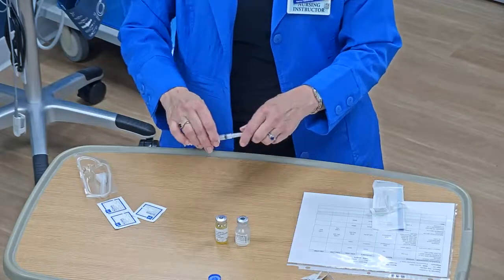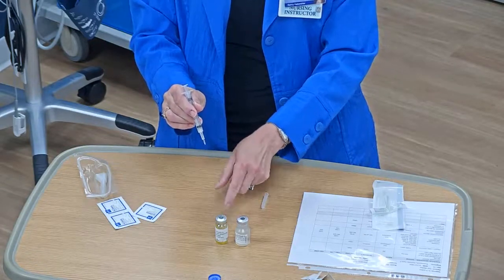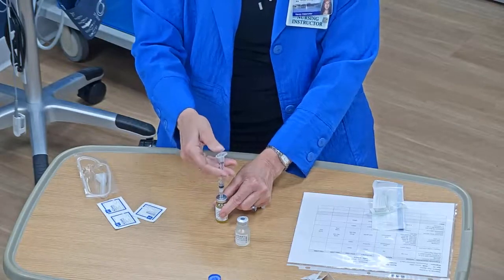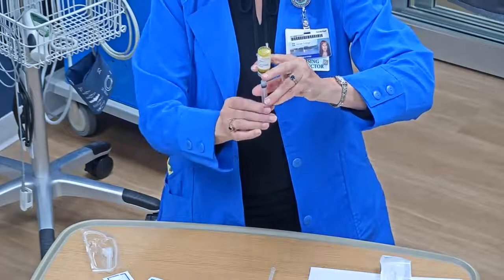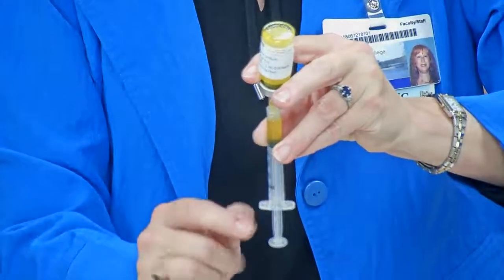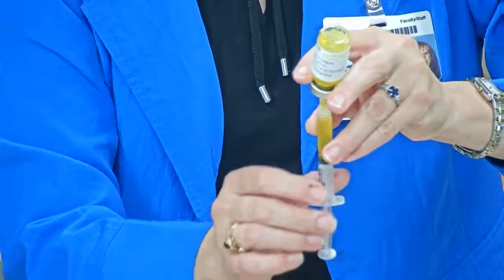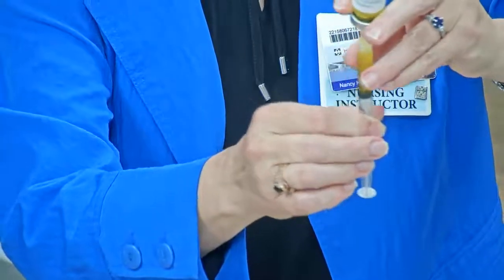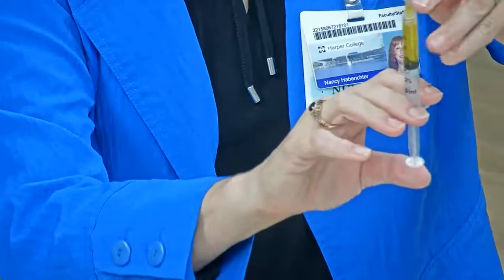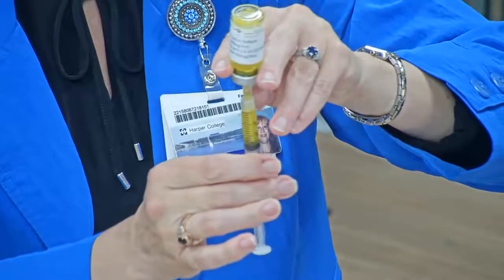Now I'm going to draw up my 1.5 milliliters. I take the cap off my vial access device. I do not need to add any air to this because the vial is already pressurized by adding that 2.8 milliliters of liquid — so don't add any air, just access the vial, turn it upside down, and draw in 1.5 milliliters. I'm only touching the hub and I pull down well past 1.5. I look for any air bubbles, flick them to the top, and push the bubbles back into the vial. Then I confirm I have 1.5 milliliters.